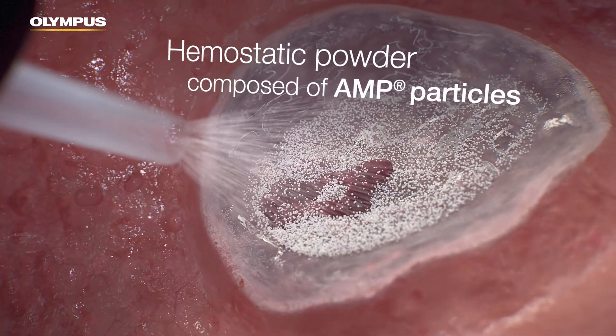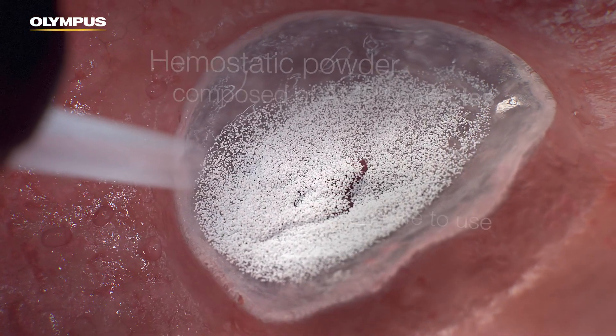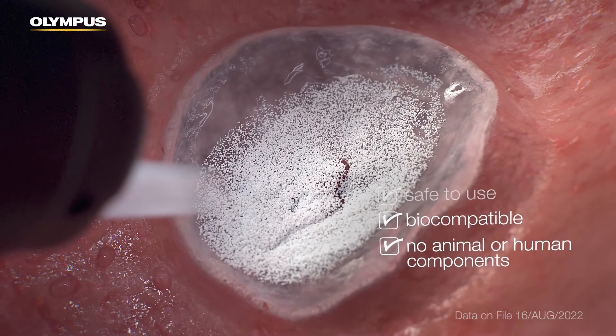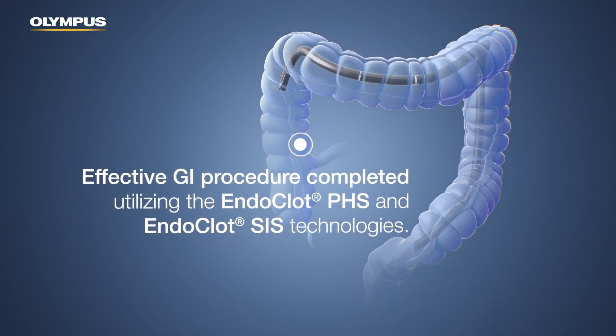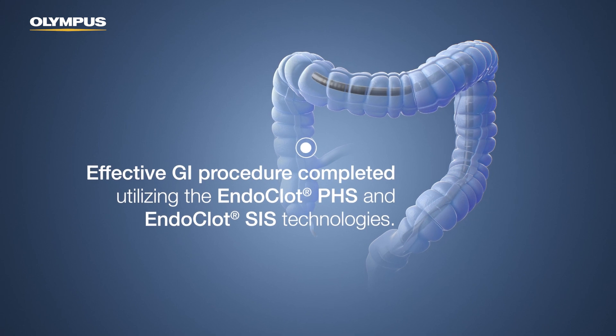The hemostatic powder is composed of absorbable modified polymer, AMP particles. It is safe to use, biocompatible, and does not contain any animal or human components. An effective GI procedure has been completed utilizing the Endoclot PHS and Endoclot SIS technologies.